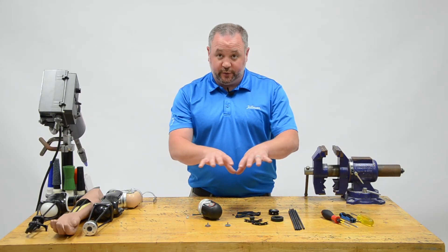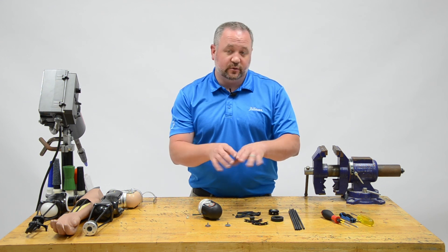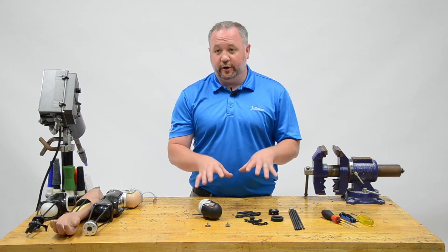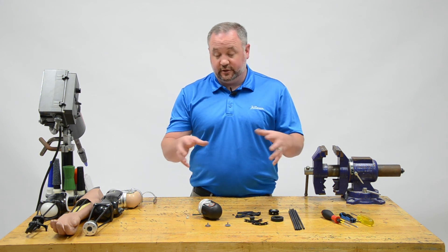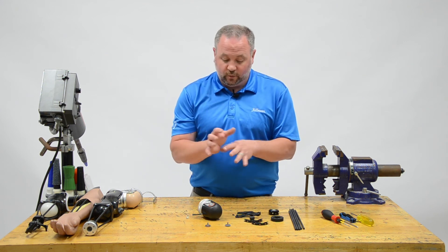What we're going to do today is put together a Nexo Transhumeral Forearm. I'm going to show you how to put it on, how to adjust it, so we'll have a general idea of how to put this thing together. It's quite simple.